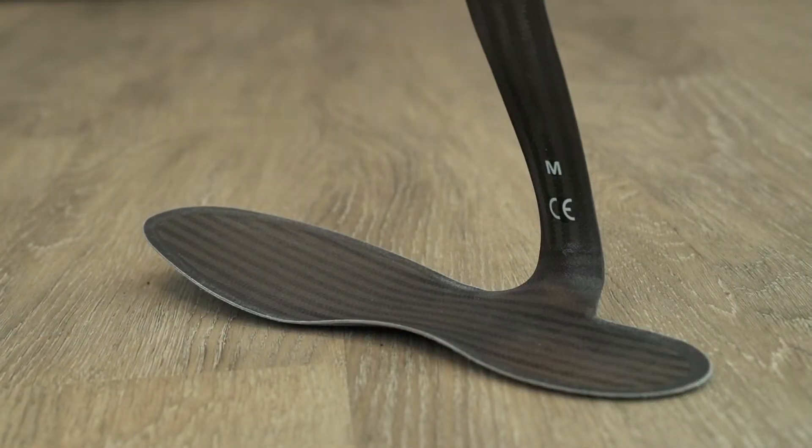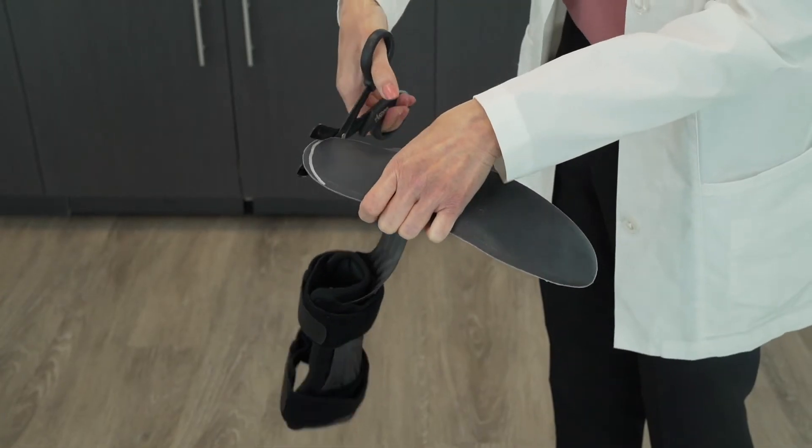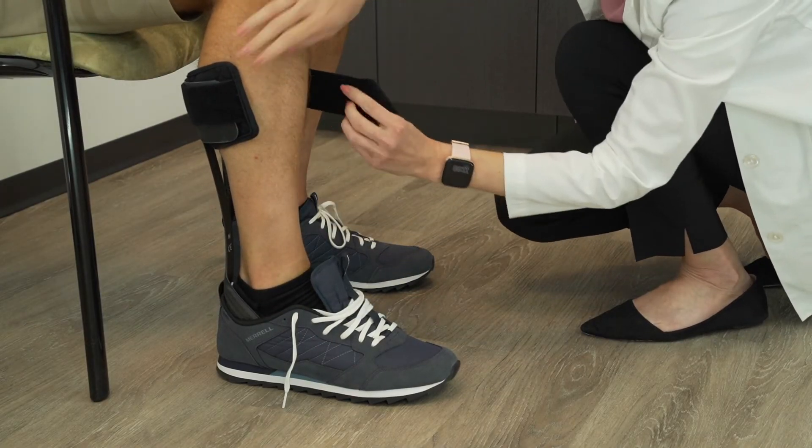The Aspen M2 AFO can also have the foot plate trimmed — anteriorly at the toe, posteriorly behind the heel, and also laterally. You can literally trim almost all the way around the AFO for the patient. This gives you a lot of flexibility in being able to fit it exactly how you need for that particular patient's shoe.